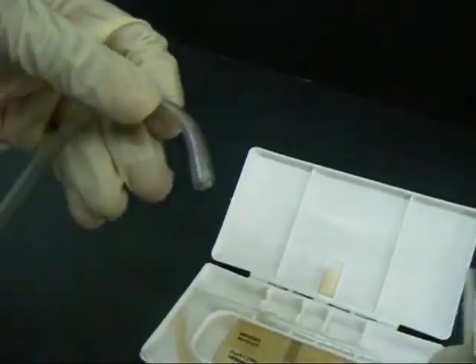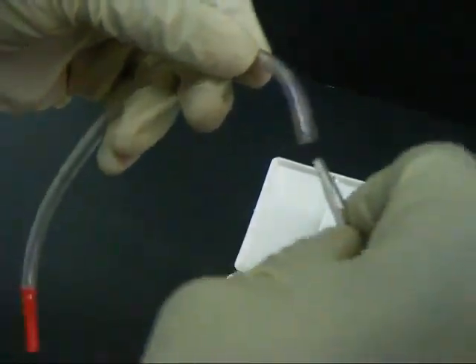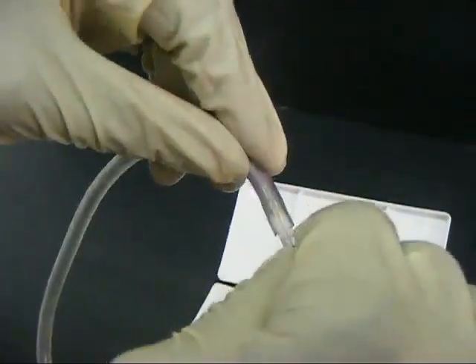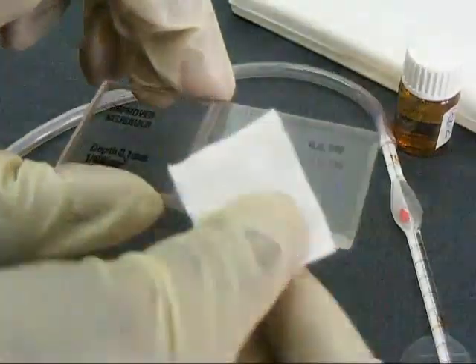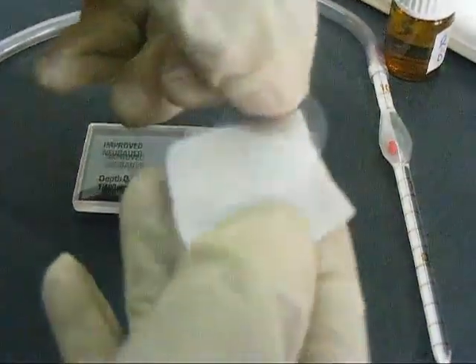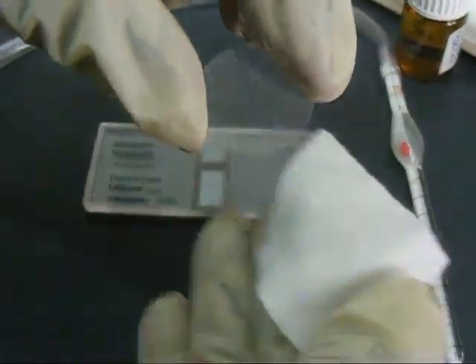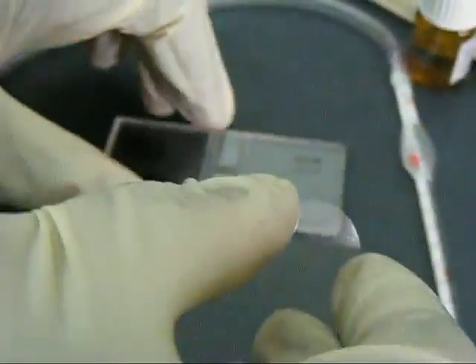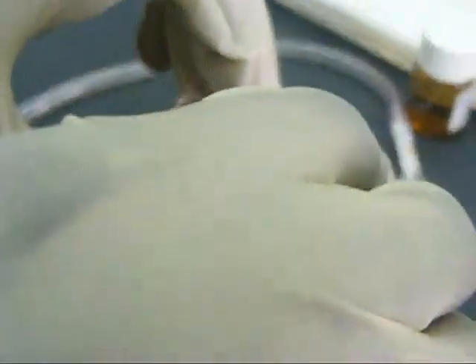A plastic tube for the pipette is attached to the red cell pipette and made ready for use. The counting area and the cover slip are both wiped with a clean alcohol swab. The cover slip is then placed firmly on the counting chamber.